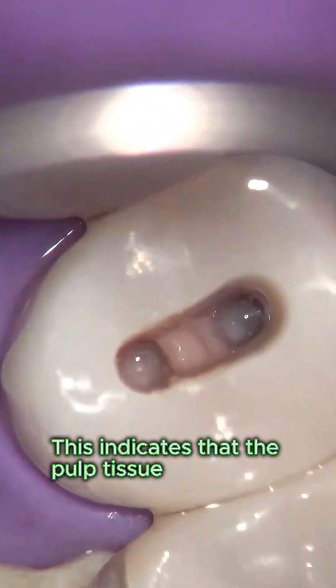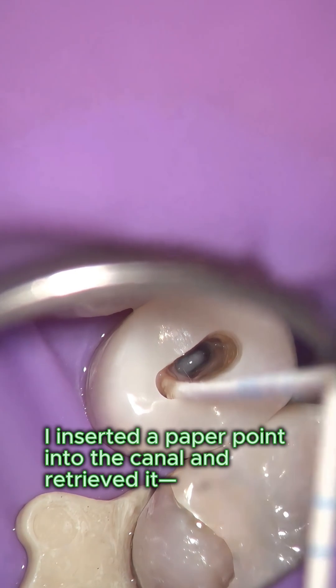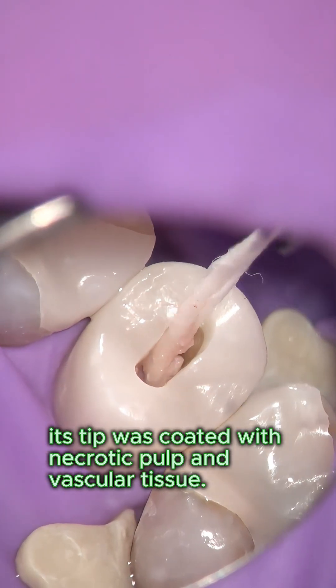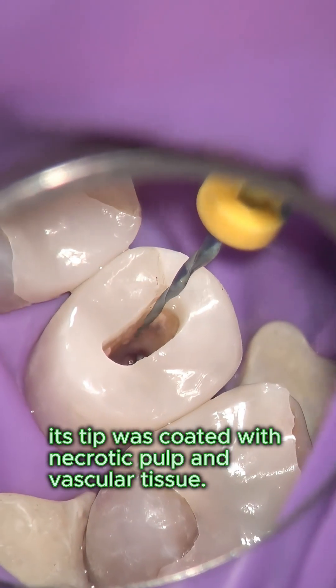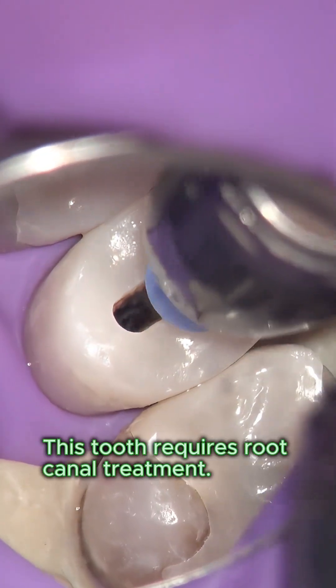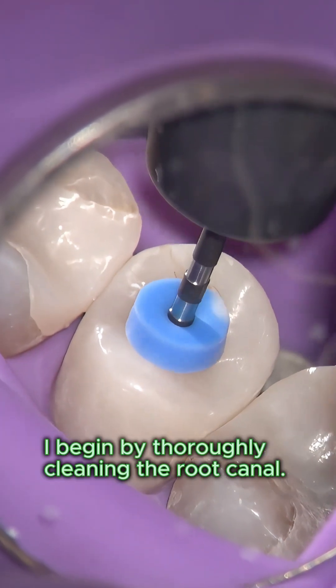This indicates that the pulp tissue is completely non-vital. I inserted a paper point into the canal and retrieved it; its tip was coated with necrotic pulp and vascular tissue. This tooth requires root canal treatment.